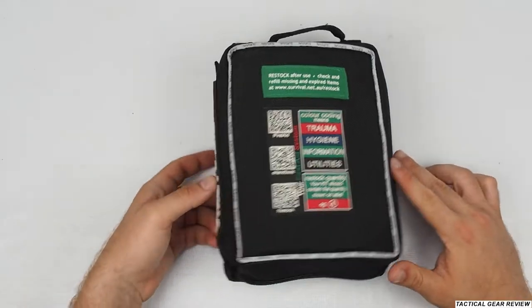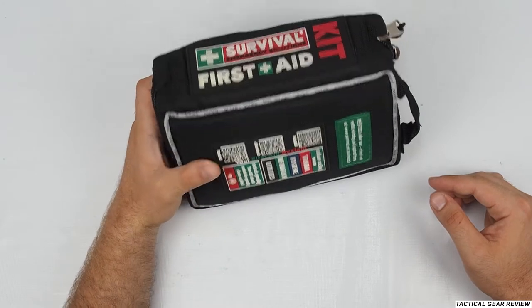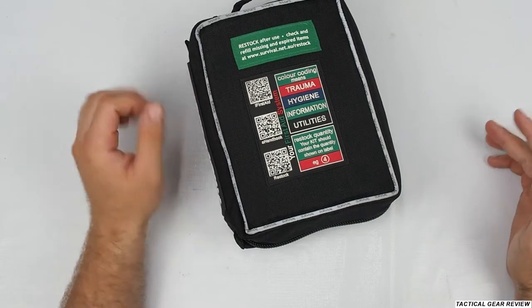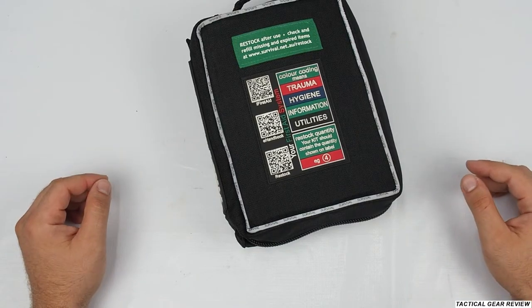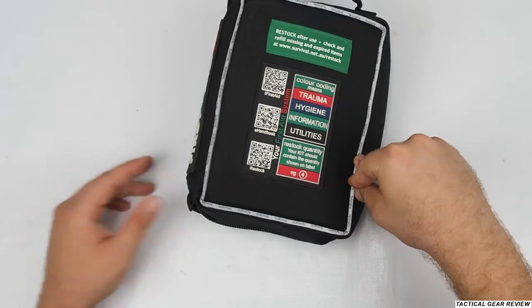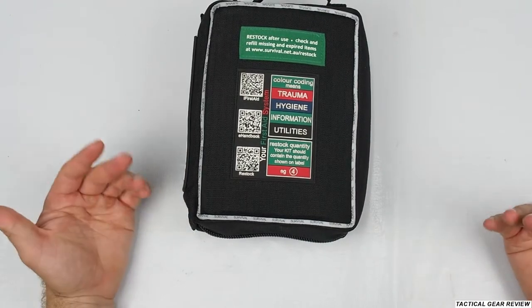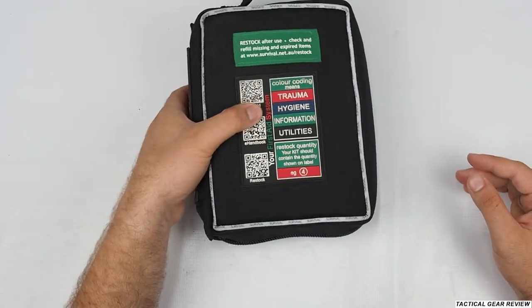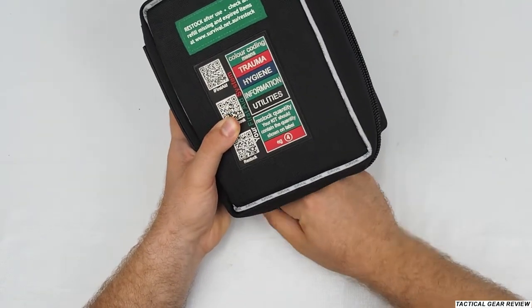Here is our first aid kit from Survival Emergency Solutions from Australia — a really nice kit. As I said before, I think it's the best kit in the world for me. I use this kit in my car as an everyday EDC first aid kit. I already restocked it, so I'll show you what I added and what you get when you buy this kit.